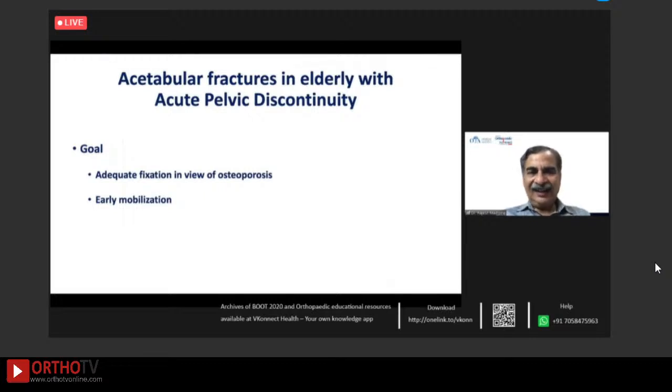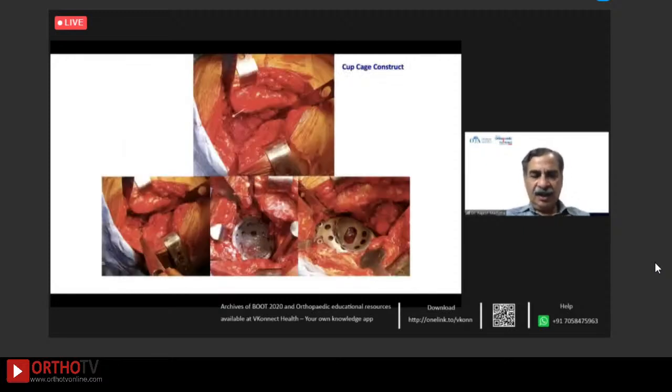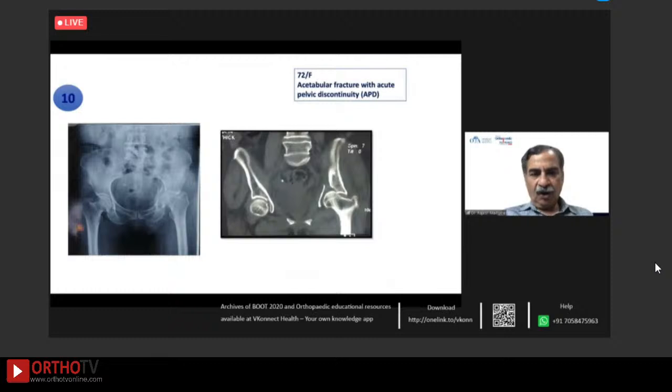If we have an acetabular fracture in elderly, particularly in Indian scenario, a comorbid with high risk for surgery, where you want to do one surgery to get him up and about immediately, to provide adequate fixation and early mobilization. So this is an example, acetabular fracture with severe comminution, not amenable to reconstruction. We use the cup cage construct, we use the trabecular metal shell, we remove the ring so that it allows us to put these screws at the very periphery, and to get the hold into the bone where it's possible. And then because we don't have the original cage available with us in India, we use a Burch-Schneider cage as an innovation, and then we put in a liner and then put the whole lot of bone here to restore the bone stock. And this is a follow-up of the same patient.